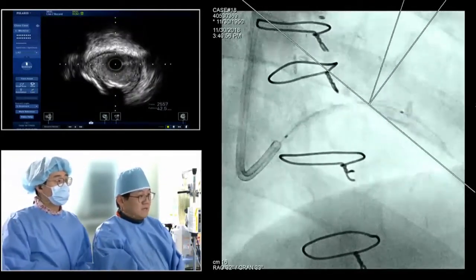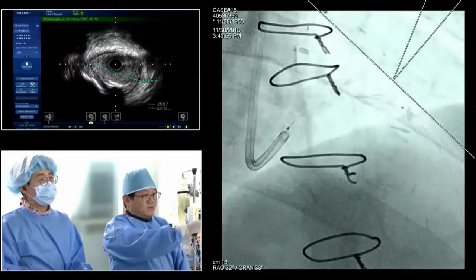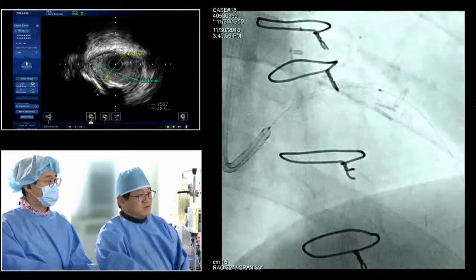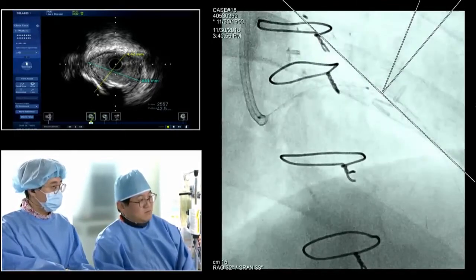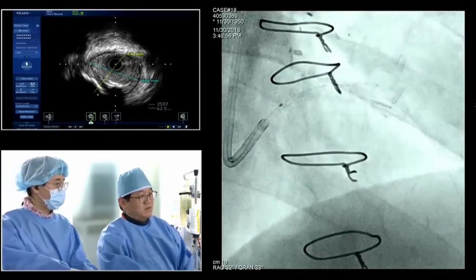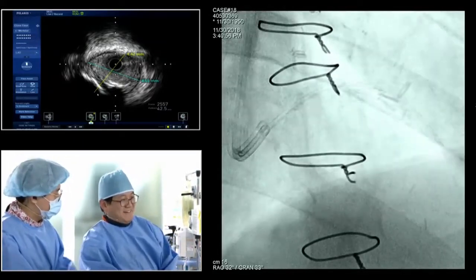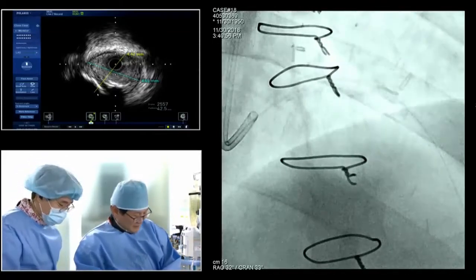After stenting, it's my idea. After stenting, flow is recovered. So inside of the stent, there is fast flow, and outside of the stent, in the aneurysm area, there should be some blood stasis. It can make, sometimes, I hope, in the future, the aneurysm packed with thrombus. Then the thrombus can disappear in the future. Hope so. Yes, it is my idea. Anyway, it's an idea. Nobody knows.